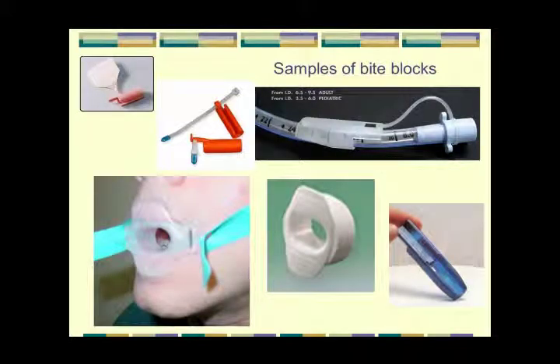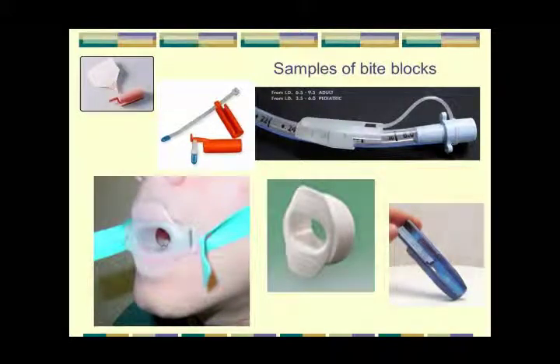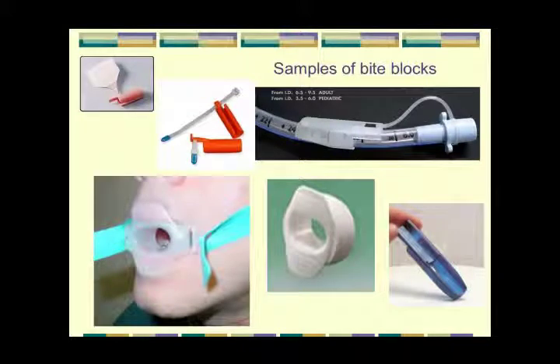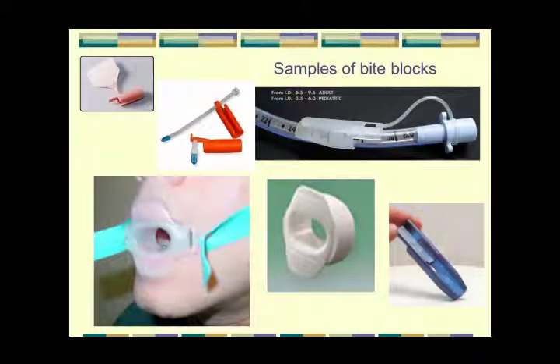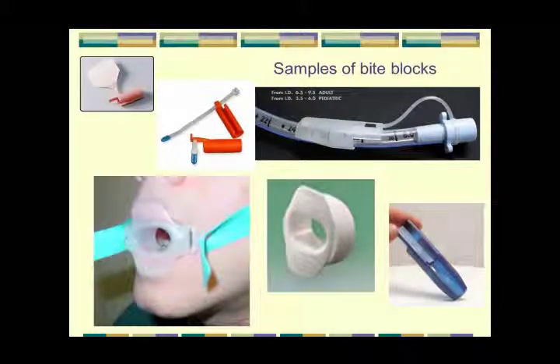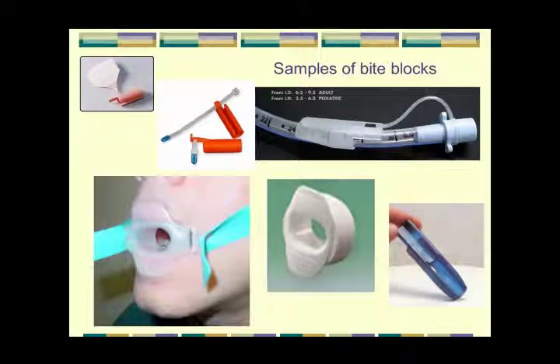Skip it. They should not be used as bite blocks. A lot of ICU nurses will use these devices as a bite block. It causes gagging. Oh, you look like you're gagging, sir. Here, have some propofol. Okay, well, that'll solve the problem, but the better idea is to get something else as a bite block, not using the tube. Okay? Or not using the airway. There's all kinds of devices that are out there for that purpose.